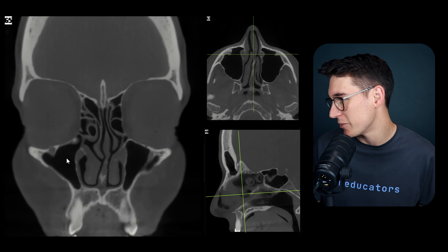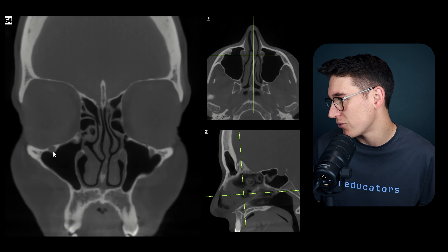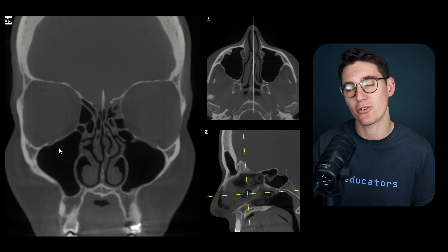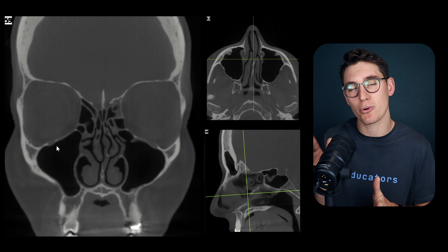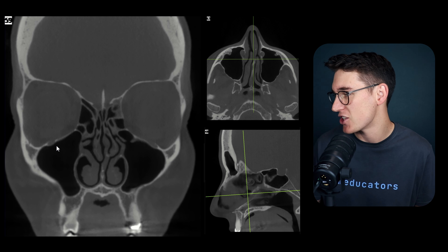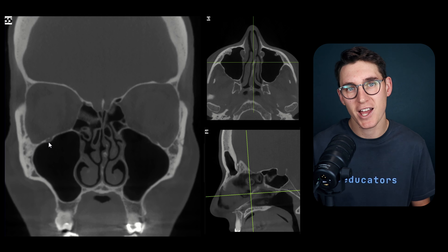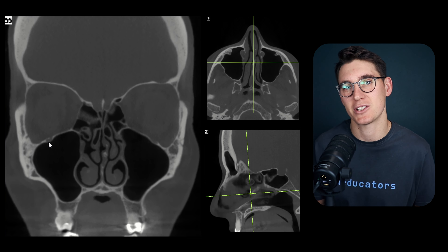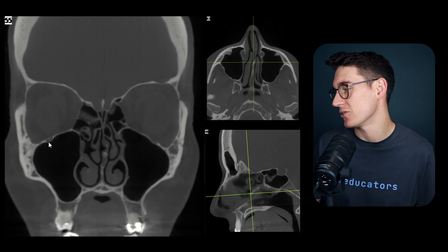There's a canal running along the floor of the orbit - this is the pathway for the infraorbital nerve. The infraorbital nerve is a branch of the maxillary division of the trigeminal nerve. Recall from our neurocranium talk that the maxillary division passes through the foramen rotundum. Let's trace the pathway of the infraorbital nerve.